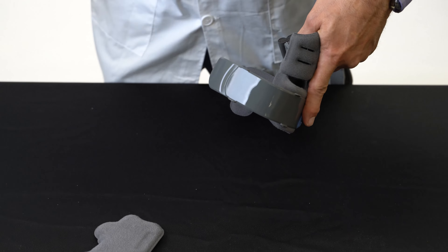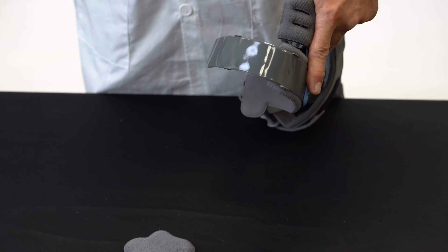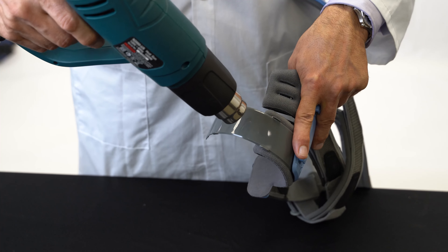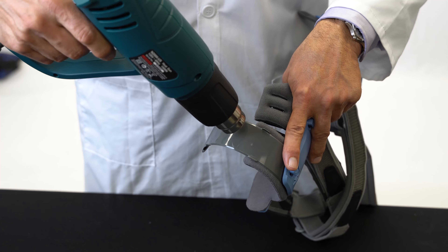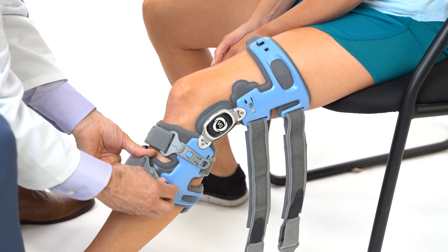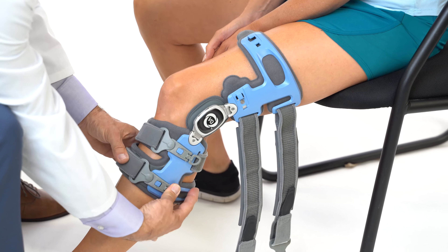Alternatively, with the brace off the patient, heat the plastic 10 to 20 seconds over the tibial crest area only, keeping the heat gun moving and taking care not to burn the pad. When the plastic is moldable, apply the brace and form as above.